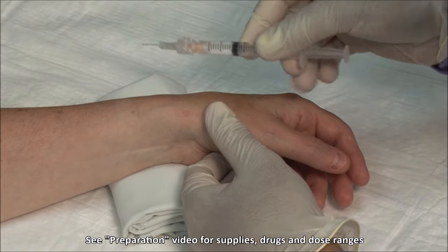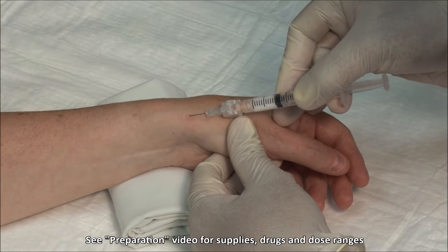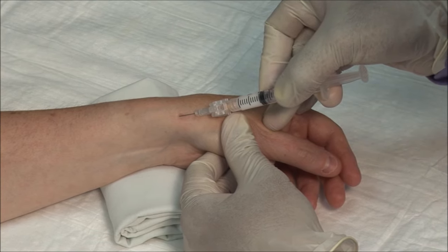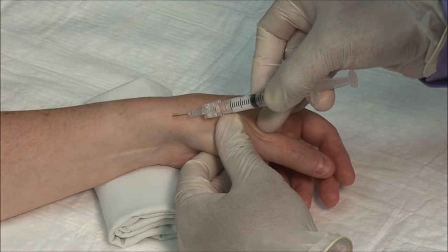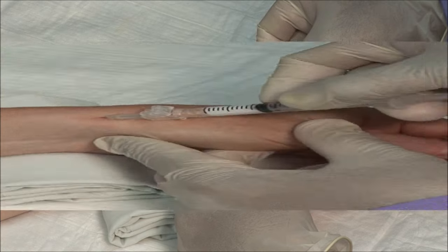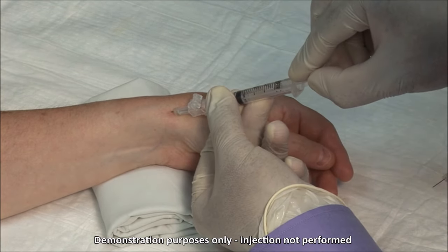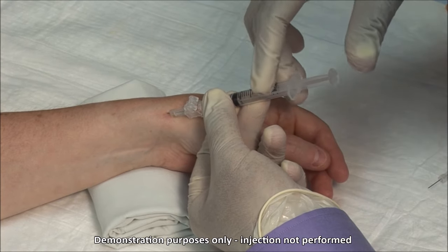Advance the needle alongside the tendons, aiming towards the elbow for about 2 cm. Always aspirate to ensure that you are not in a blood vessel. Then inject the solution.